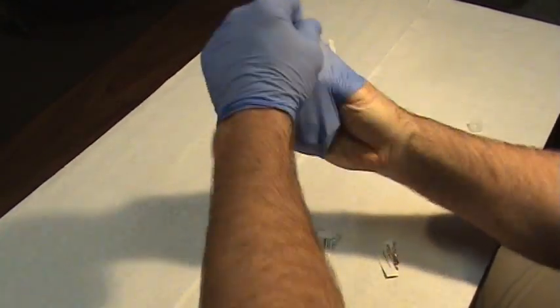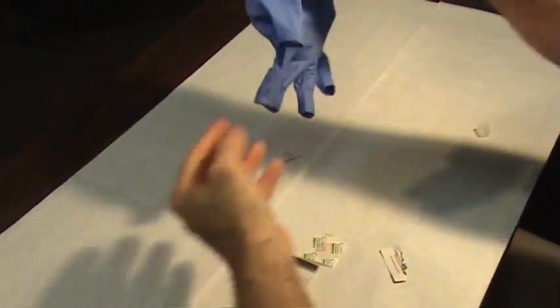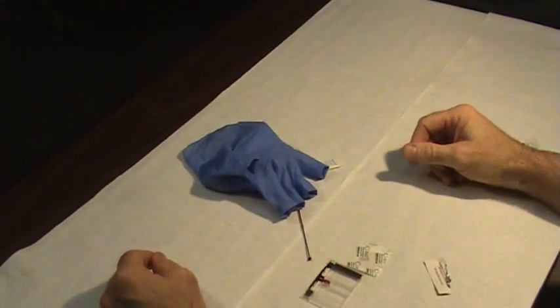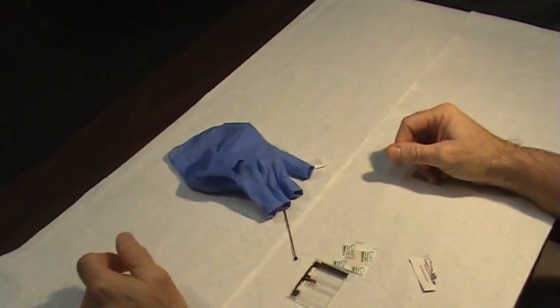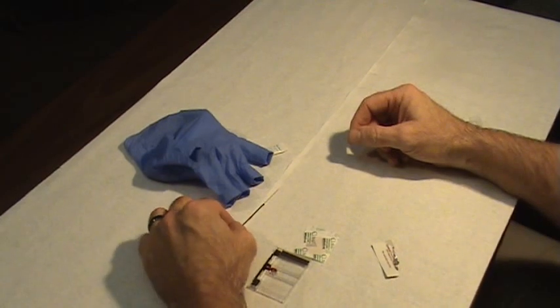Then you take your glove, pull it off to the end, do it again on the other hand and now you have your sample all secured. It is not required by law to have those in HAZ boxes or blood kits for removal.